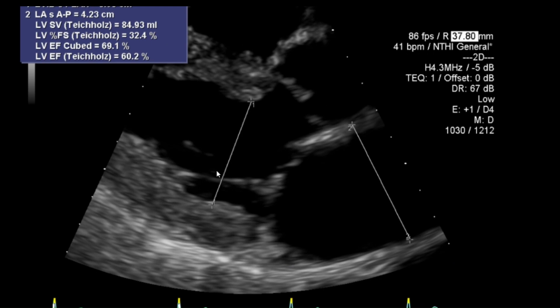Similarly, I'll look in systole at the left ventricle, and also at the left atrium — particularly in this case given there was a history of atrial fibrillation.